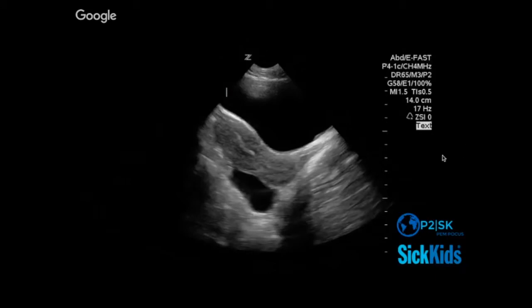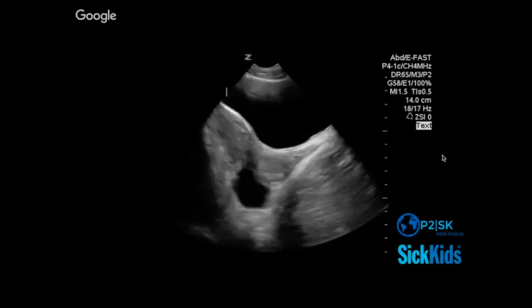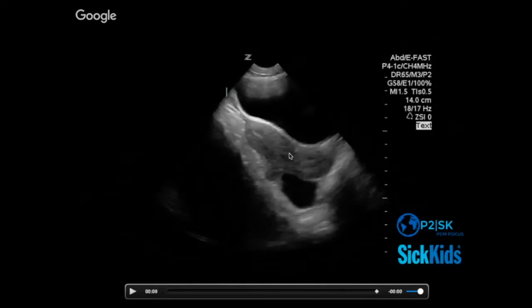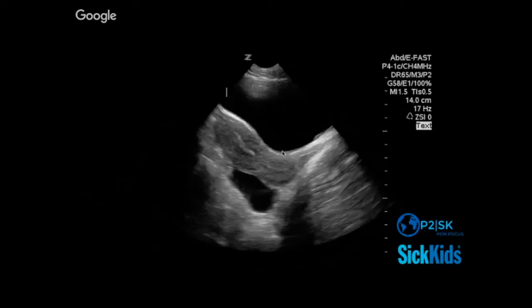And so we'll go and we'll do a pelvic view as part of our FAST. And what's this structure here that I'm circling? Sorry? Ovary? So try one more time. Uterus, I hear. Yeah. You see the endometrial stripe within? And this oval appearance of the fundus. And it comes down to making the corner of the cervix down here.